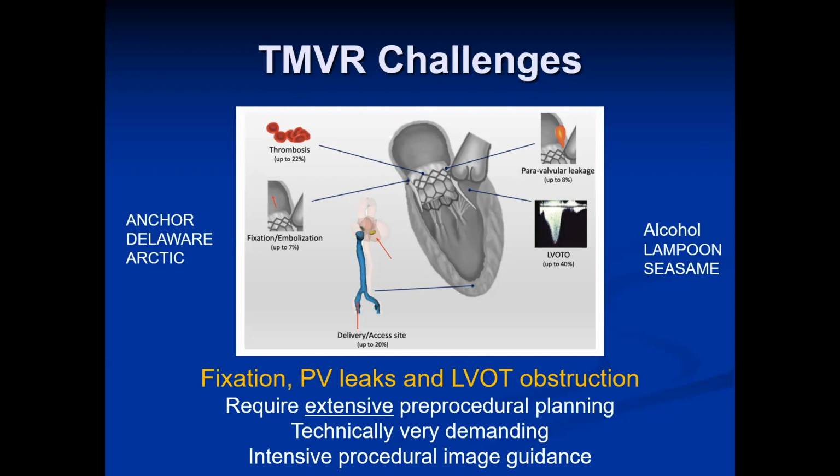Same thing on the TAVR side. We were really concerned that we would never be able to take a TAVR prosthesis out without replacing the root. We're getting better at it, so it doesn't completely exclude that. That's what I'm saying. There's an opportunity for improvement, because in those patients that fail clips, we go with the mindset of trying to salvage the situation and minimize the risk.